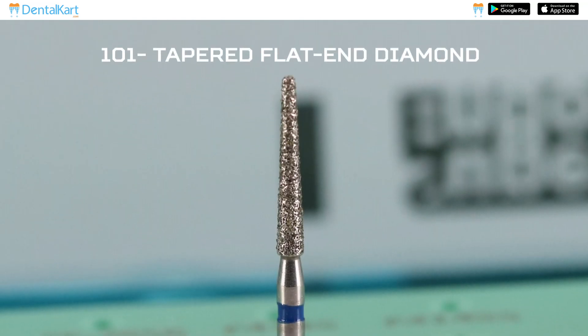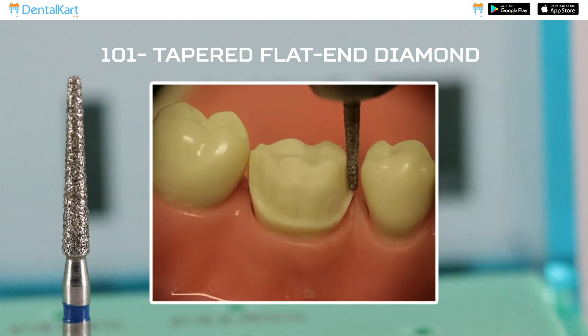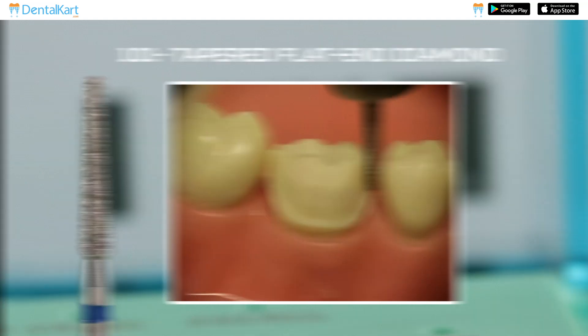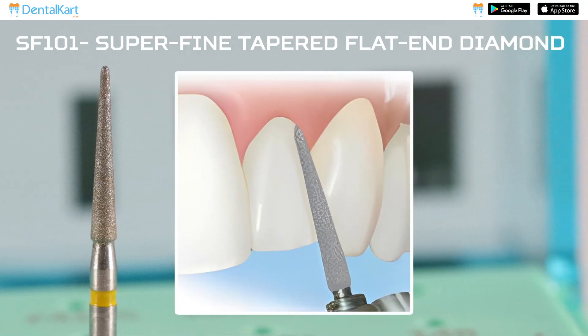1-1 Tapered Flat End Diamond Burr: This burr is used for preparing axial, proximal, and occlusal surfaces. It is also used for depth cutting and for preparing shoulder margins for PFM crowns. 1-2 R SF 101 Super Fine Tapered Flat End Diamond Burr: This is used after the tapered flat end diamond burr for smoothening.